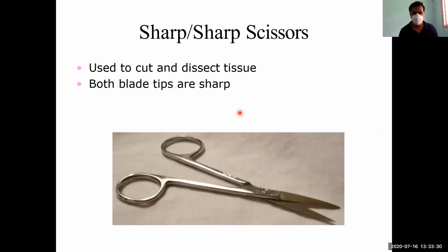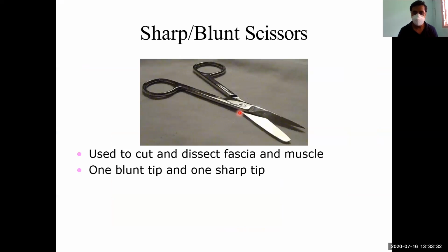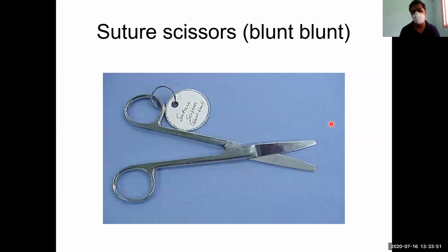So what are those things? Let's go to the first one. Scissors are of various types. Some scissors we use just to cut the suture after giving the knots. Right? So for this mainly we use the blunt one, both the ends blunt. Mostly we use this for blunt dissection purposes. Suture cutting scissor, you can say. Yes, suture, it has been written.